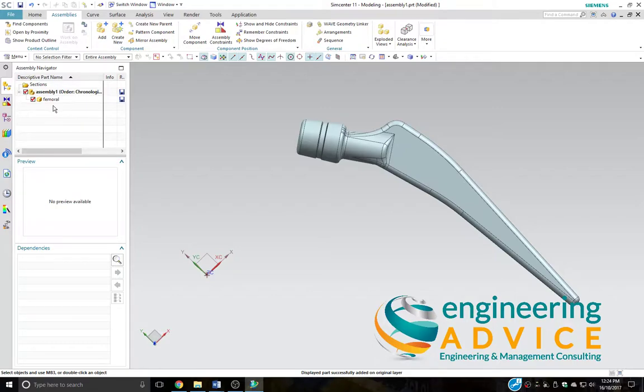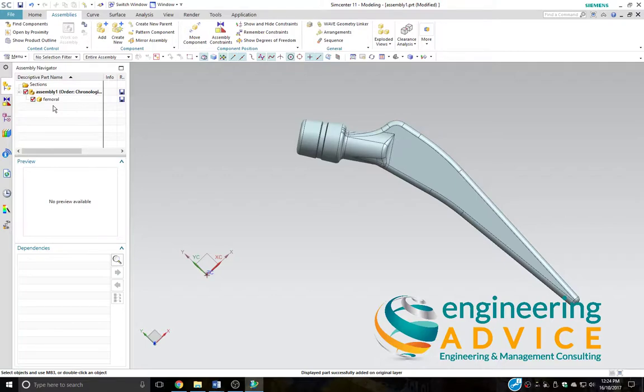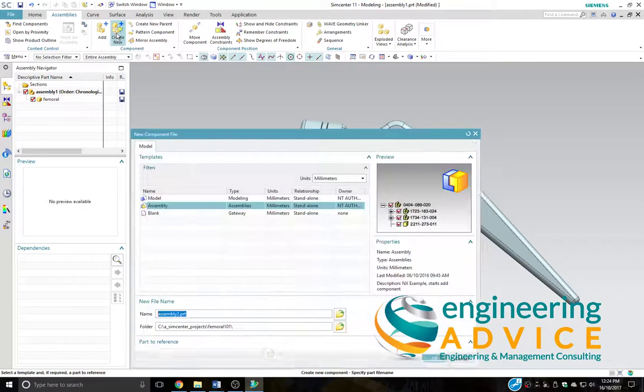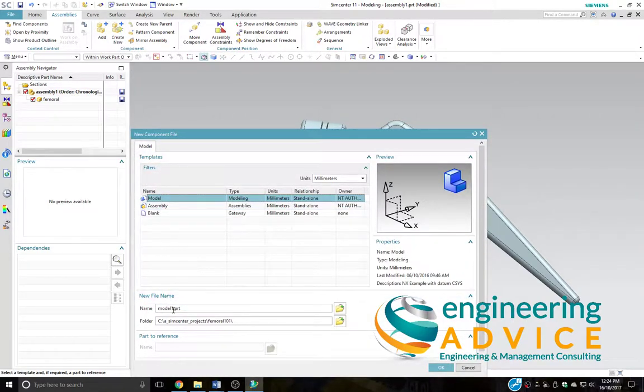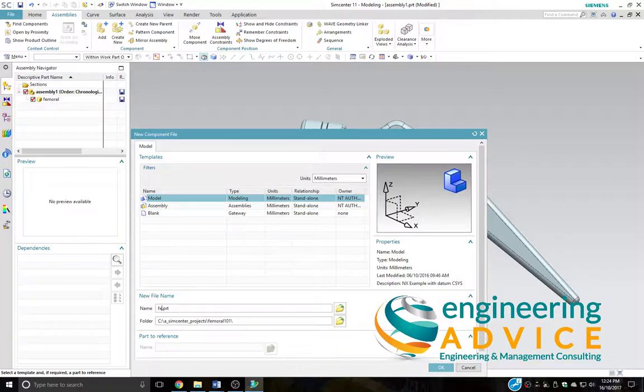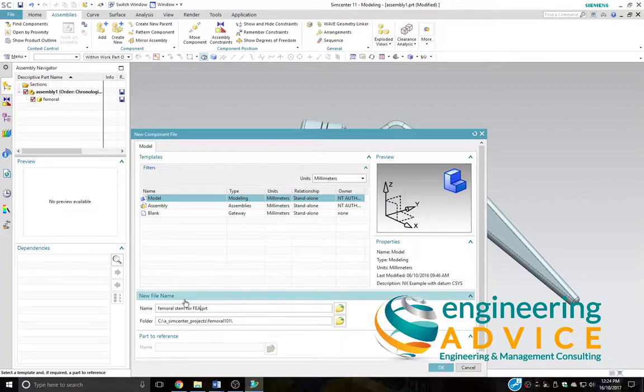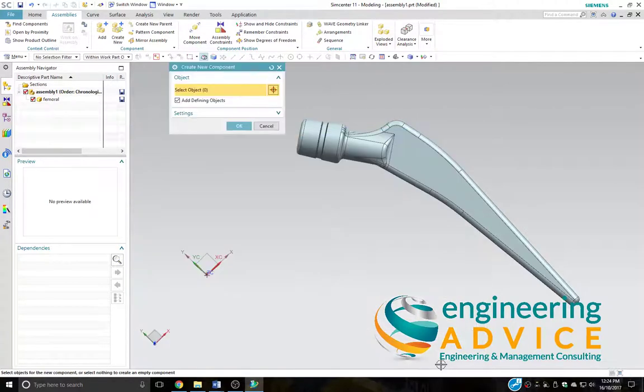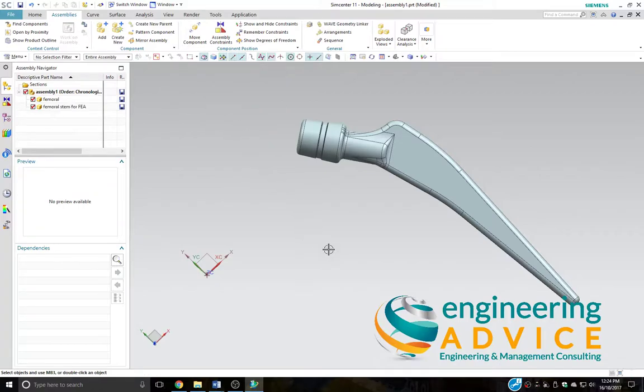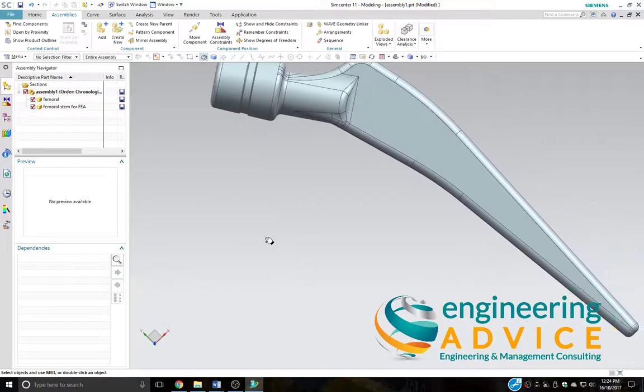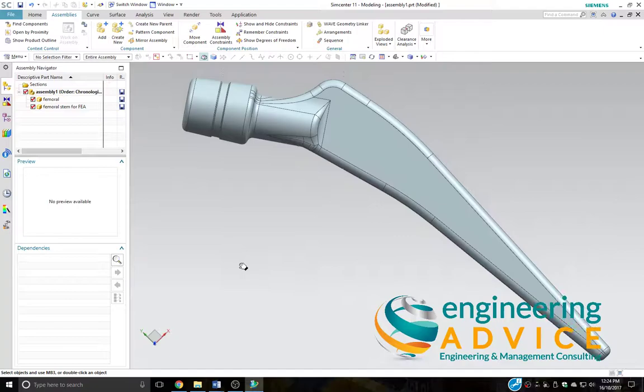The next task will be to create a dummy repository for the CAD information that we're going to use that will be describing our FEA model. So we're going to create a new part, and I shall call that femoral stem for FEA. That's OK. No need to select an object as yet.